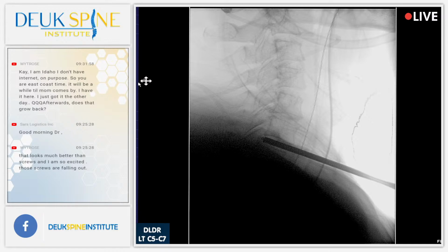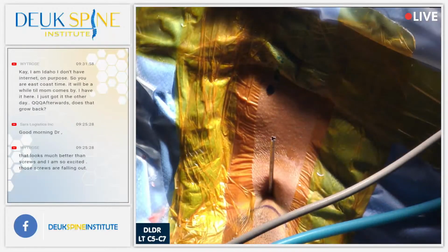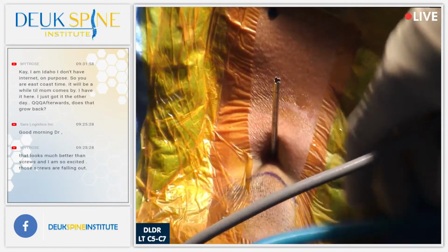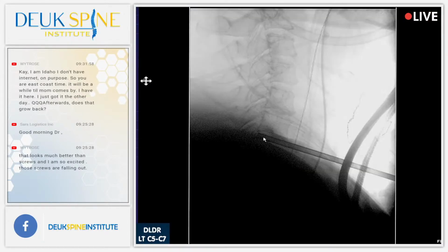So I've brought the tip of this tube, Jordan. The tip of the tube is at the back of the tear. Show us where the tear starts. Nope. Inside. There. Right there. Right where the arrow is. That's where the annular tear starts. And show us where it ends. There. So our tube is literally sitting inside the annular tear where the herniation came out of.